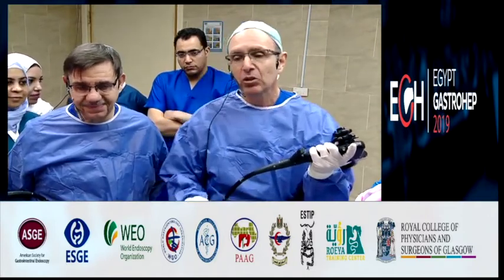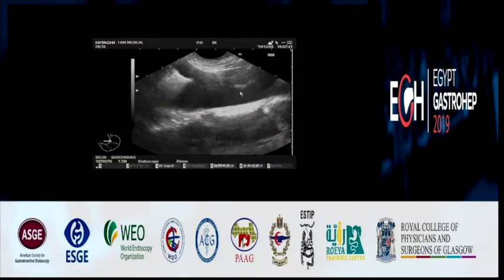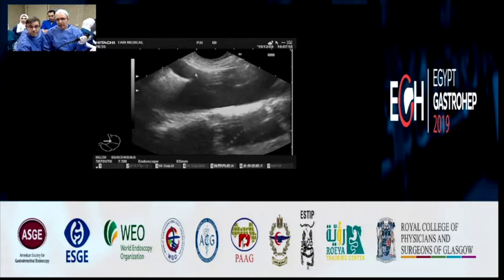So you know this patient's history, and even though we think that the patient has a mass in the head of the pancreas, usually I begin through the stomach and see the body and the tail of the pancreas, looking for lymph nodes. That's just one way to do the examination. Usually I see the aorta and the celiac trunk, as you may see here.